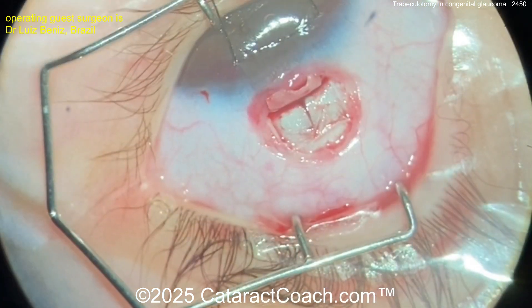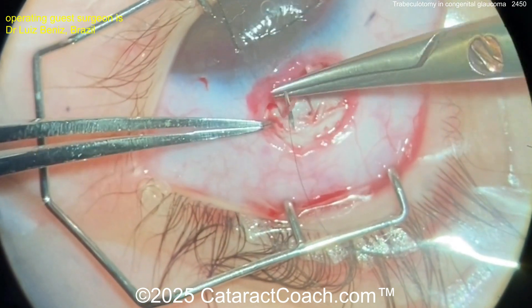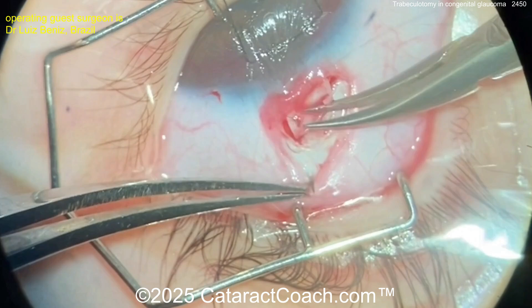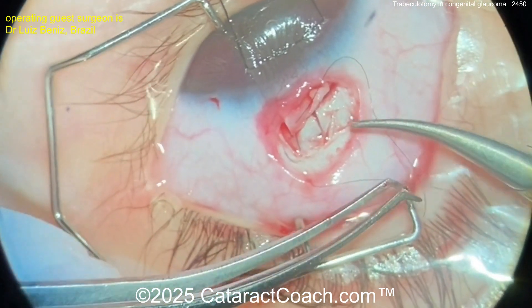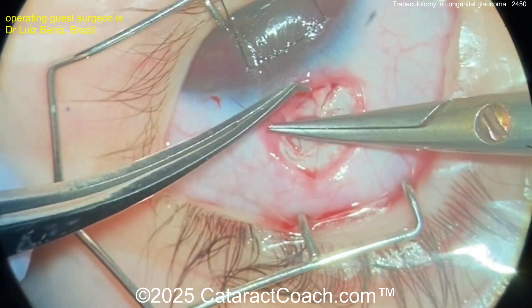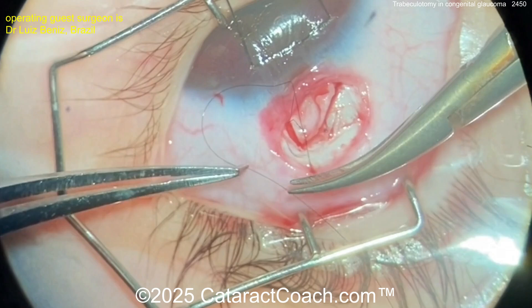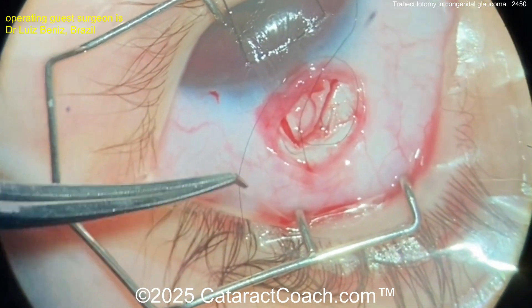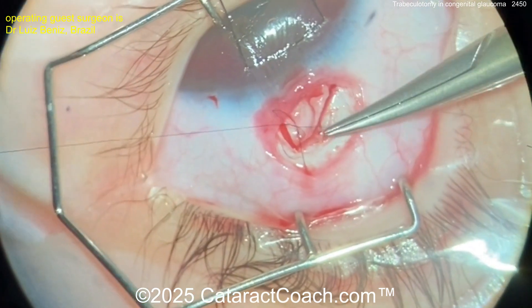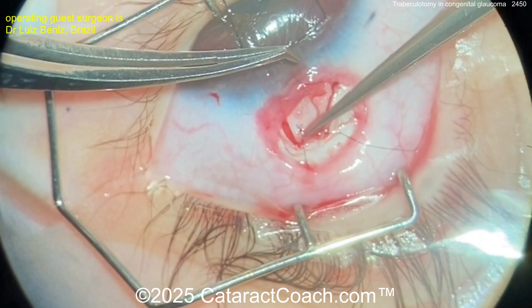Look at that — a lot better flow of aqueous now. See this flap down — beautiful. That was very interesting; I really like that. It's a very innovative technique. You pass this 5-0 prolene around, and then you mark the suture by putting a kink — a bend — in it. That was super smart. You learn something new every day, including me. I keep learning. Now suturing down this flap.